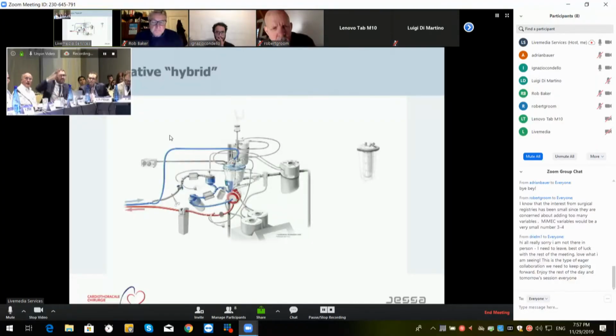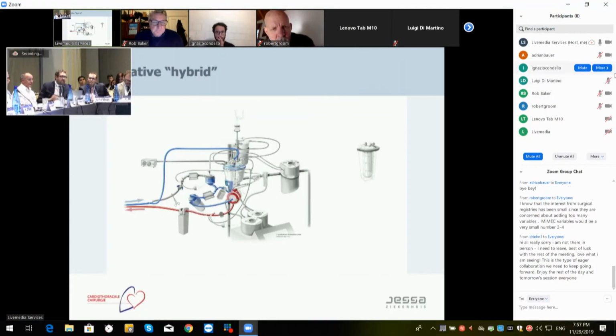So what we do here, this is the EVO, which is on the S5. So basically, what comes in, you put it on percentages, goes out. So it makes my job very easy. Just what comes in goes out, and that's it. So you have a steady state. You don't have any flow going up and down. But still, it's perfectly possible with a hybrid system.